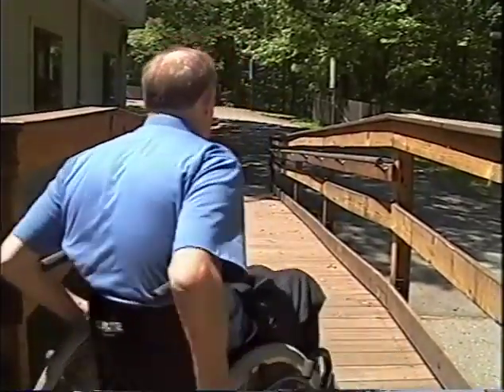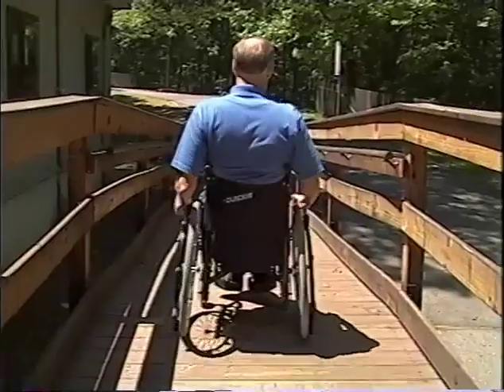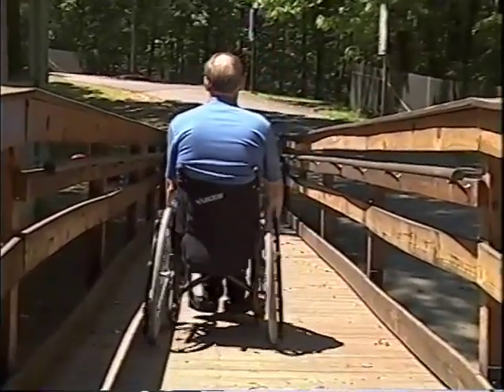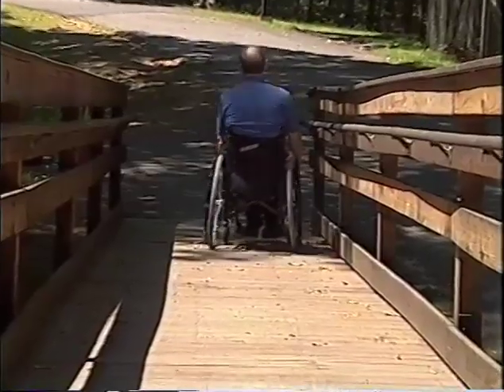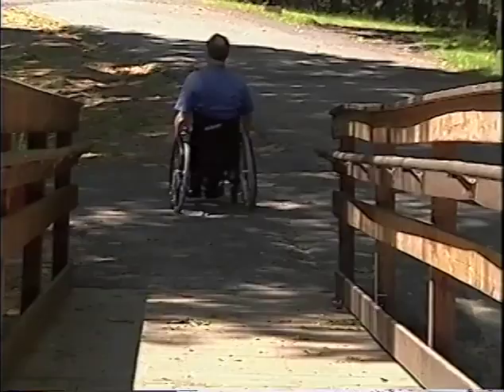Okay, and going down, once you get your front wheels over the transition point of the ramp, now you can transition to your brakes. And left for left and right for right, but just let them slide between the two things. Lean back when you hit the bottom of the ramp too.